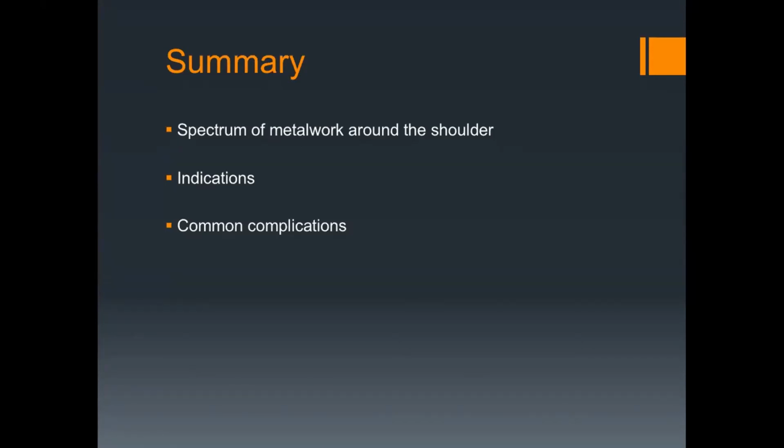So the modified element is basically the mechanism that's used to hold that down. It could be a screw, it could be one of those suspensory mechanisms that I use, which is how I do them. But it could be anything that holds that down. It could be a hook plate. That's the modified element of it, because basically they found that they were all subluxing.